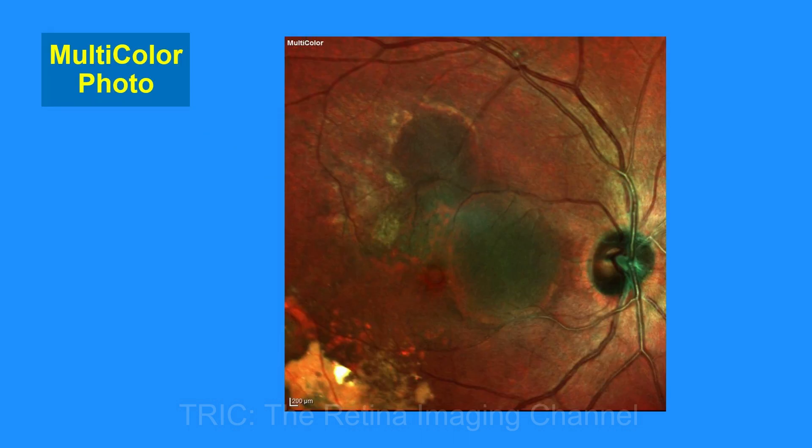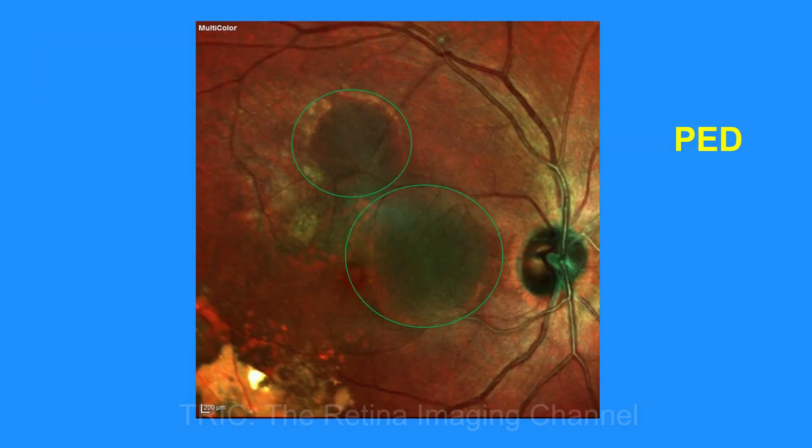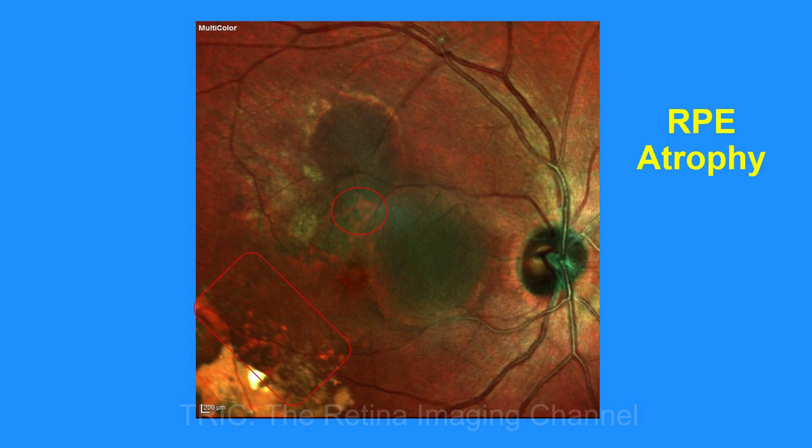This is a multicolor photo of the right eye of a patient. The green circle here shows two dark areas which are PEDs. The red rectangle and the red circle show the areas of RPE atrophy, and the green circle below shows hard exudates.